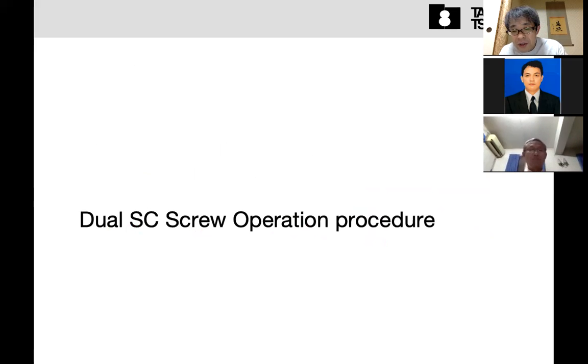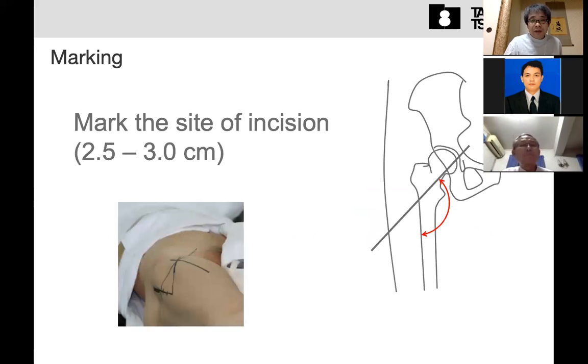So maybe next should be the operation procedure. To do the femoral neck fracture fixation, the marking is very important. So this is my technique.